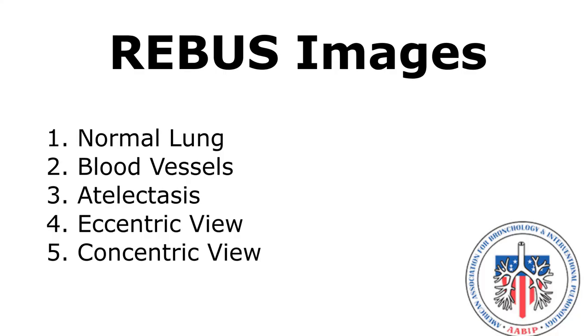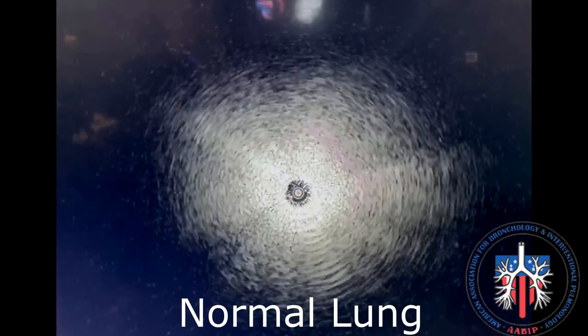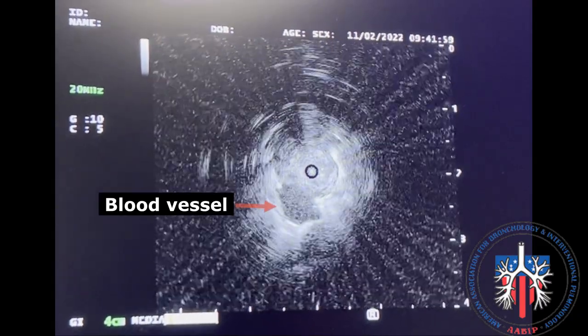We will now review the following rEBUS images: normal lung, blood vessels, atelectasis, eccentric view, and concentric view. Normal lung is characterized by a snowstorm pattern surrounding the center of the probe. Blood vessels are round, anechoic, and may pulsate.